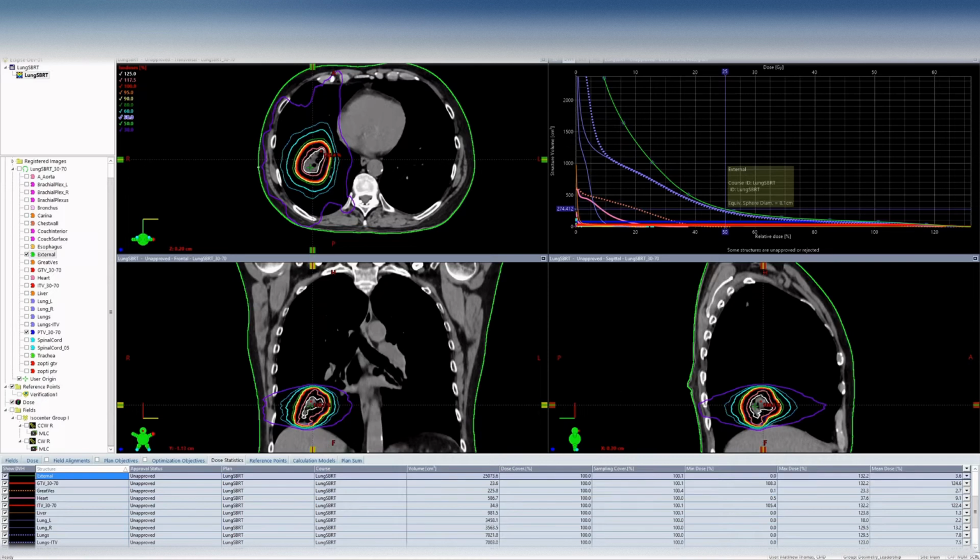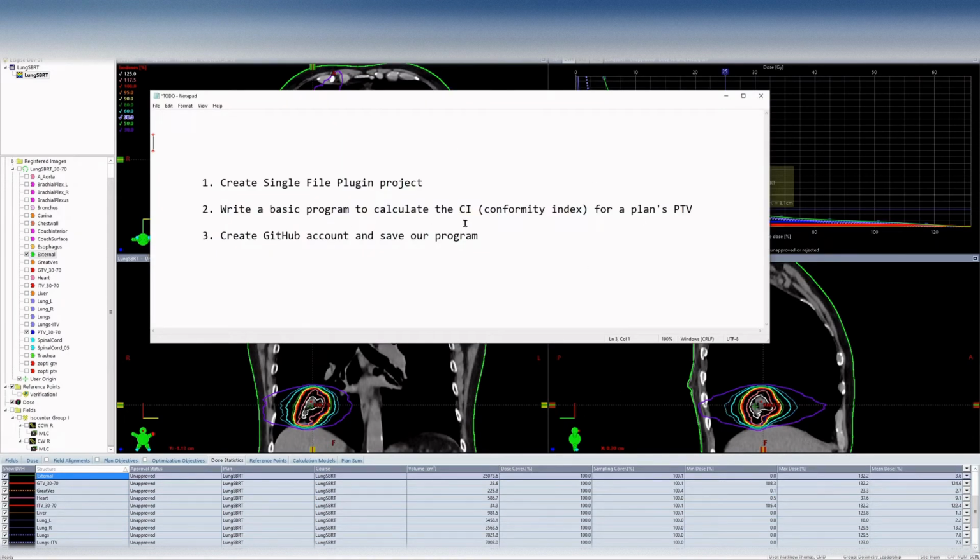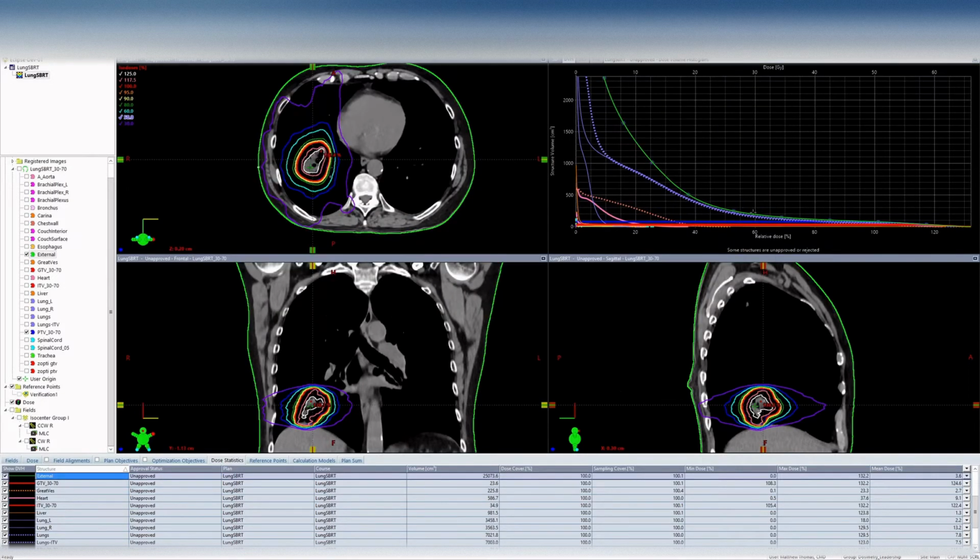So that's the goal, the reason that this is useful, right? We don't want to have to do this manually. And we didn't spend that long to do this. We just kind of put this in. Maybe you have a spreadsheet or whatever. But now you want to do the CI or the R100, and then you want to calculate the Paddick CI, right? So you can imagine we can just write a script that will calculate those things for us and present them to us within a few seconds, right? So that's what we're going to do.